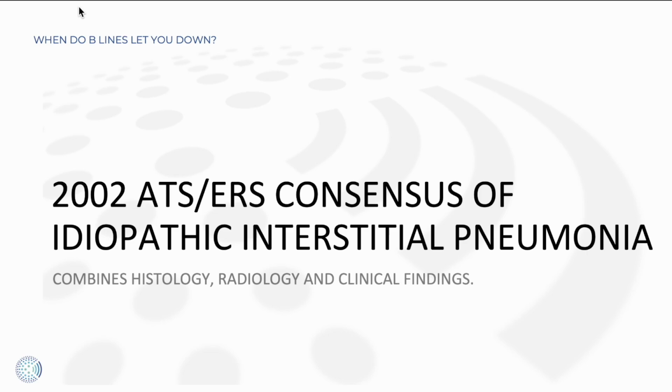To help us in understanding what B-lines means in lung point-of-care ultrasound, let's actually look back at some of these consensus documents published by the American Thoracic Society and the European Respiratory Societies. Back in 2002, it set up this classification of different patterns of interstitial pneumonias. Sensibly, it's always ranked from the most common to the least common.